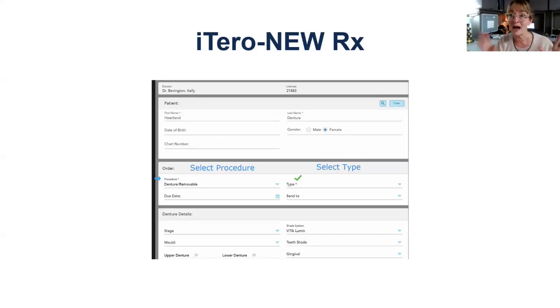So originally AI was created on all these systems to eliminate our fingers, the patient's tongue, the inside of the lips, the cheeks, and it took a while, but it worked great. We were no longer having to cut away and trim lips and cheeks and tongue. So that was fabulous. And then, it's supply and demand. So then dentistry demanded that the scanners also be able to scan for removables. The problem is when it's tissue and it's not dentition, AI, although smart, wasn't quite smart enough yet. It would keep cutting away the tissue. And I'm sure that's part of what you experienced in trying to scan the inside of a denture.